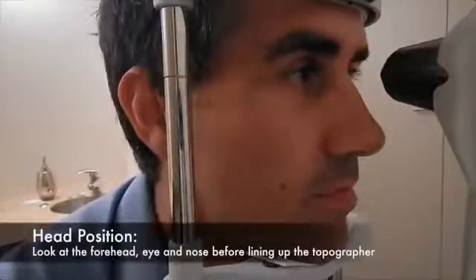Good corneal topographical capture will vary based on the relationship between the forehead, eye and nose for each patient.